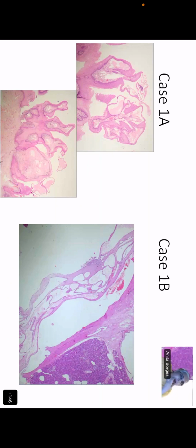Now, can I ask you about this on 1A? You said something about these being papillary processes. Isn't that right? Yes, ma'am. All right. So now, would you like to tell me why you think that these are papillary? I told that these are papillary. Yes, I know that, but please annotate, and use your annotation pen to tell me why these are papillary, because you used that term. Yes, ma'am. I sent you the report. Right. Okay. Now come on.